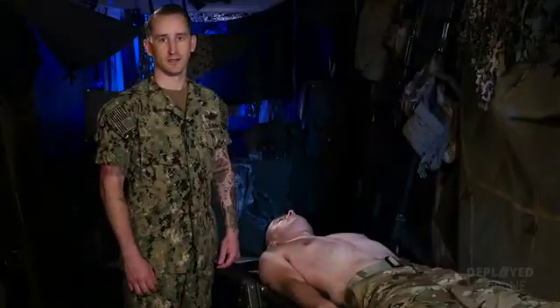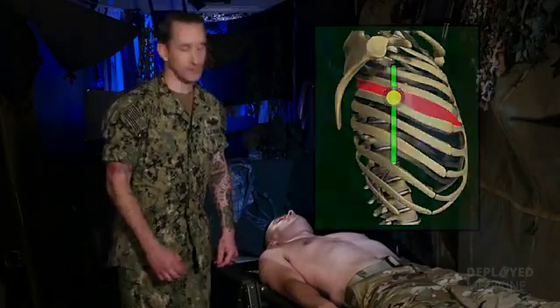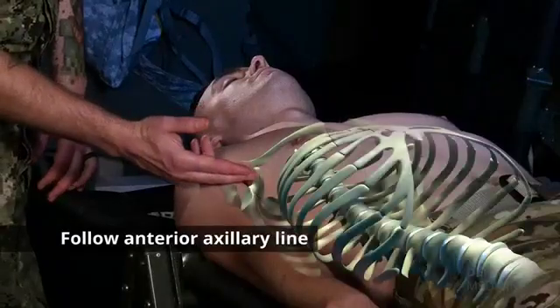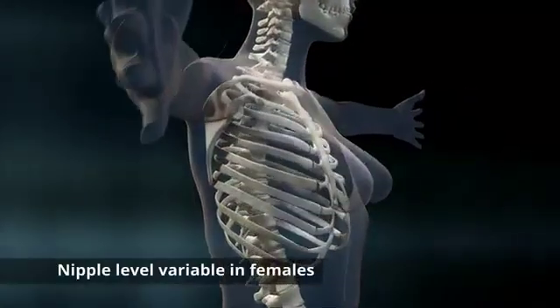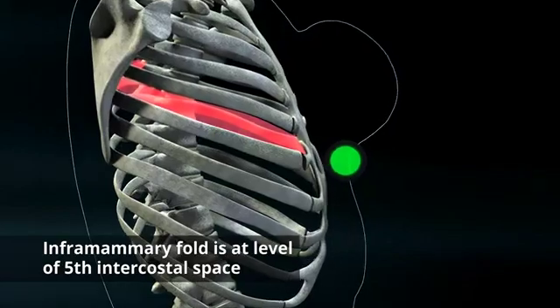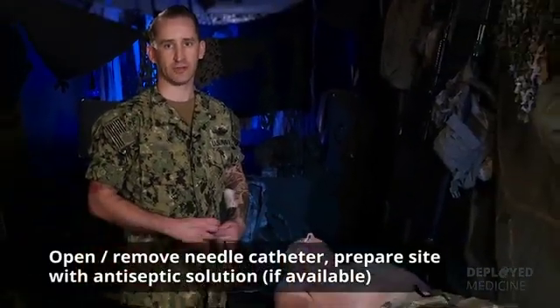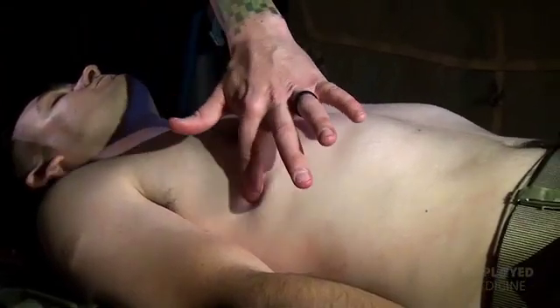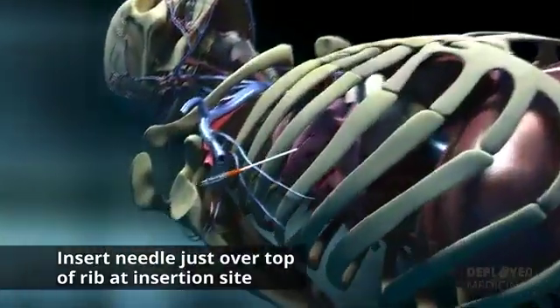The lateral site is located in the fifth intercostal space, anterior axillary line. To locate it, you're going to follow the patient's anterior axillary line to just lateral and below the nipple. The nipple level is variable in females, but you can lift the breast and use the level of the inframammary fold. Once you've identified the site, take your 10 or 14 gauge, three and a quarter inch needle catheter and begin your insertion. Following the anterior axillary line, insert your needle just over the top of the lower rib at the insertion site.